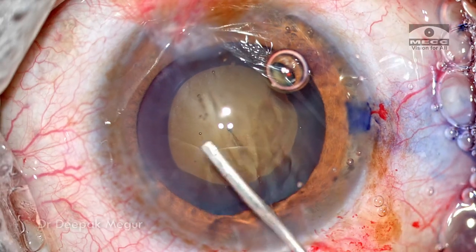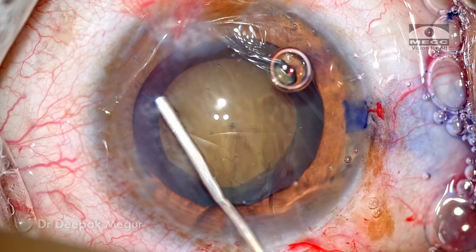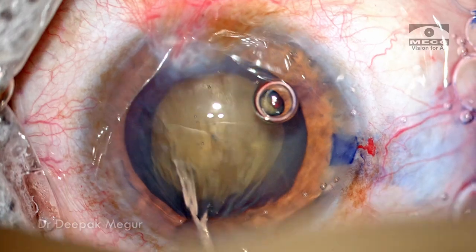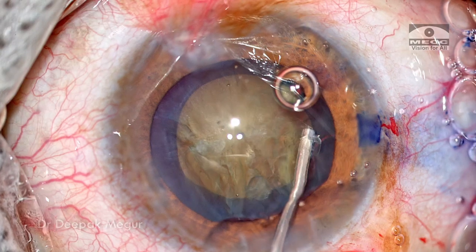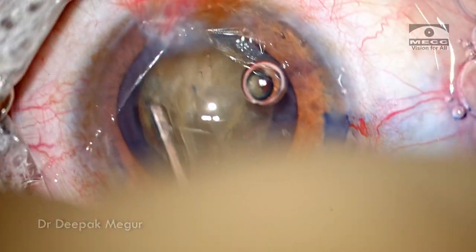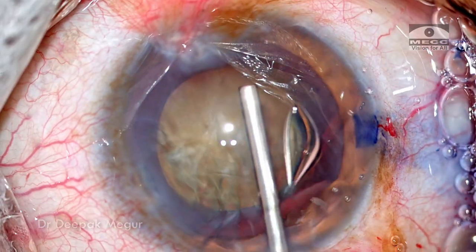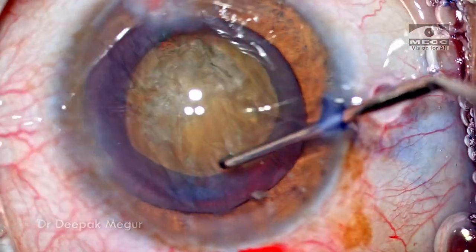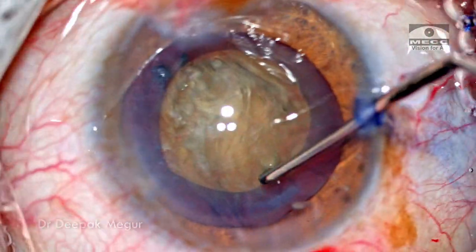With dense nuclear cataract, we need to be very mindful that the capsule will be very thin. So when doing hydrodissection we need to use very little fluid, not build up any pressure, then just tap the lens and release the fluid. If required you can do multi-quadrant hydrodissection using very small amounts of fluid. The nucleus is rotated to ensure that the corticocapsular regions are taken care of and the nucleus is well and truly mobile.